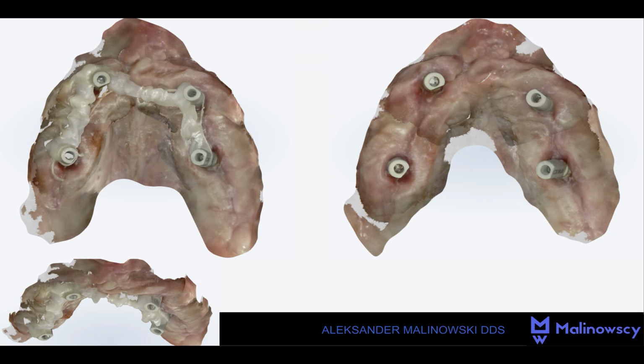We perform one scan without the tray and the second one with the scan bodies screwed to the multi-unit, and the third one with the tray. Anyone involved in analog implantology has probably noticed the similarity to the commonly used method.